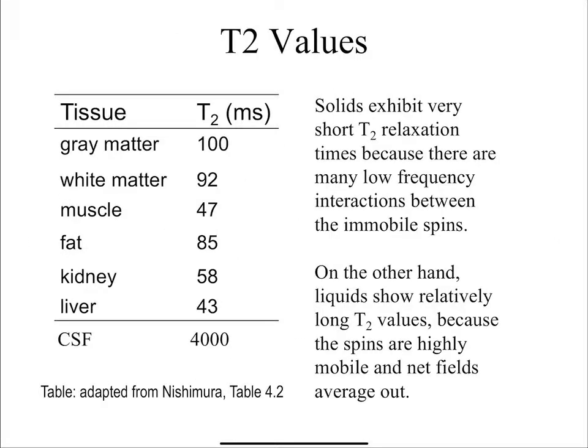And let's see. Okay. So that's T1, and then we're going to talk about T2 before we give you guys an exercise. All right. So T2, remember, is the transverse magnetization. Okay, and this actually has a different mechanism, which is basically if you imagine a lot of spins in some object, each of these spins has its own magnetic field. Okay, remember we said each spin is its own little magnet. All right. So if I have a spin over here, it's going to experience the magnetic field from all the spins around it. Okay, so if this has a strong field, if it's pointing up and stronger, and this is weaker here, then each of these spins is going to be telling this spin in the middle to either precess faster or slower. Okay, so on average, if these spins are all giving a net magnetic field, then this spin might spin a little faster, but this spin over here might spin a little slower if each spin is experiencing different instructions from its neighbors.